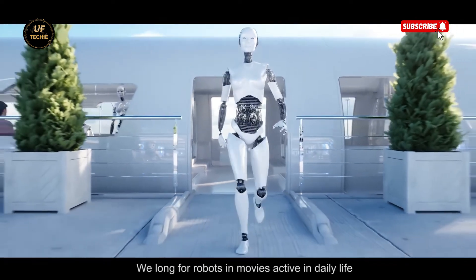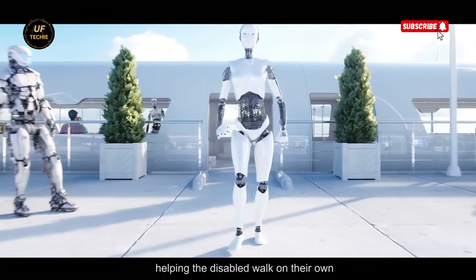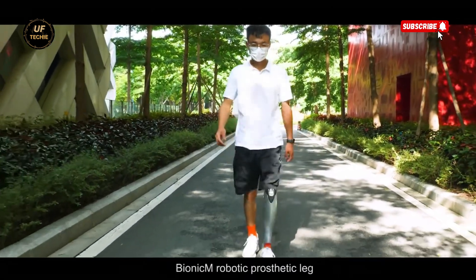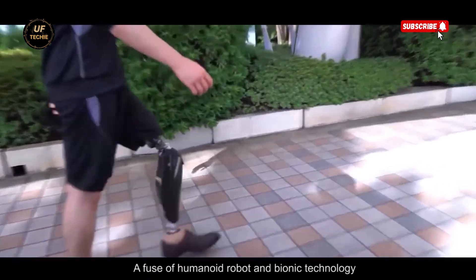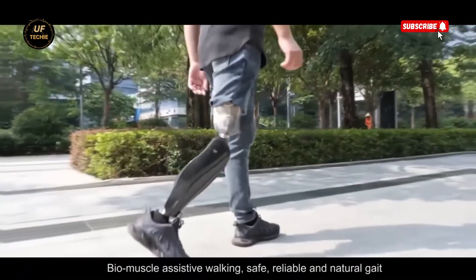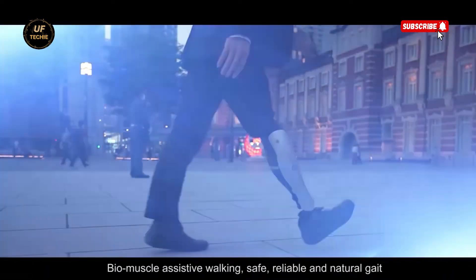For those individuals, regaining mobility isn't just about movement — it's about reclaiming their life. For years, the idea of robotic limbs helping people walk again lived only in science fiction. But today, that dream has become a reality with the revolutionary robotic prosthetic leg by Bionic M. The Bionic M robotic leg is not just a prosthesis — it's a breakthrough in human-centered robotics.